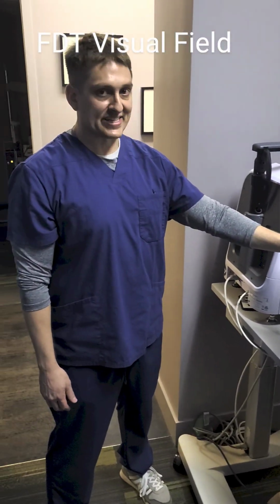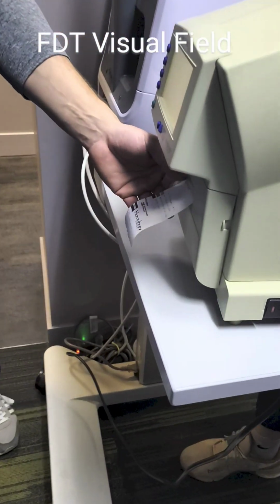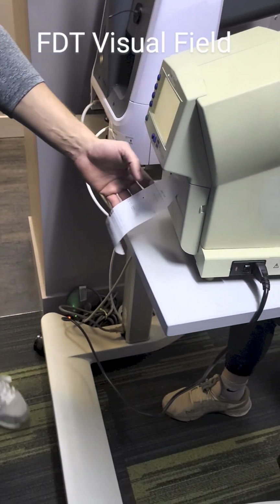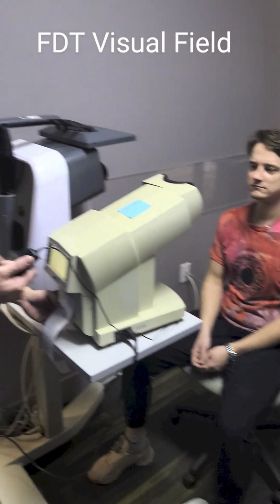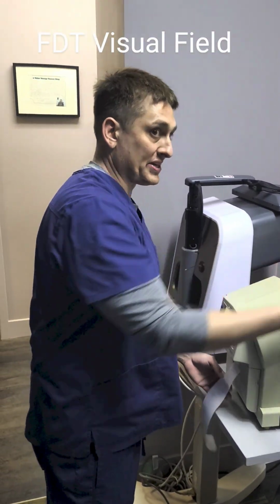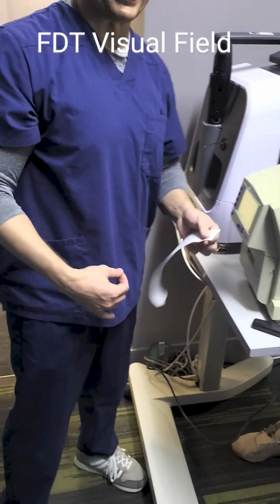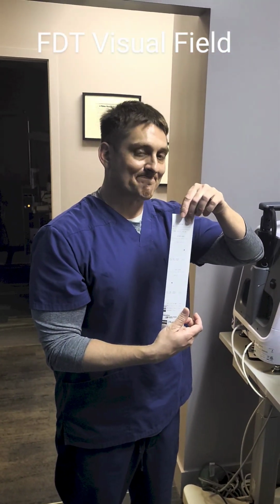And once the test is done, you'll automatically get a printout of the patient's test results, and you can take the stimulus button from the patient, clean this with an alcohol wipe as well as the area where the patient's face was touching, and make sure you paper clip this to the patient's chart so it can be used during the eye exam.